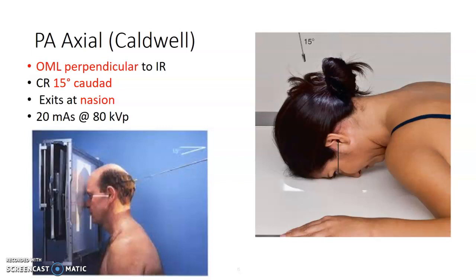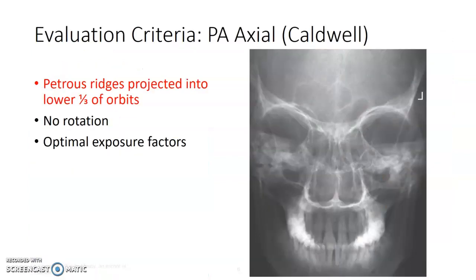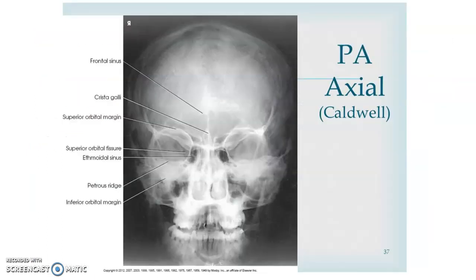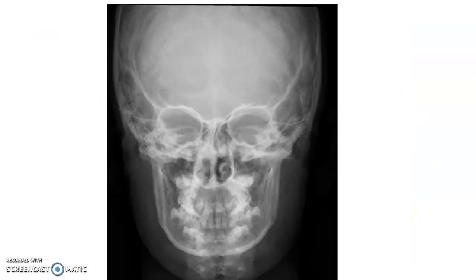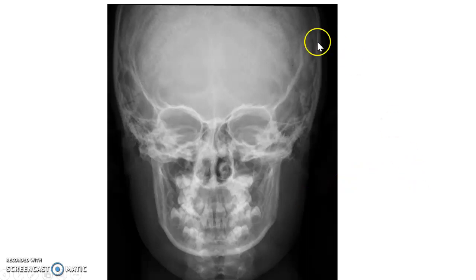For the Caldwell, the central ray is 15 degrees caudad, exiting at the nasion, and the petrous ridges are projected into the lower one-third of the orbits. Looking at this x-ray demonstration, I want you to evaluate it for quality. The first thing jumping out at me is collimation — we've got down to the C-spine, we've got the whole skull. Do we need that? No — let's collimate it in.